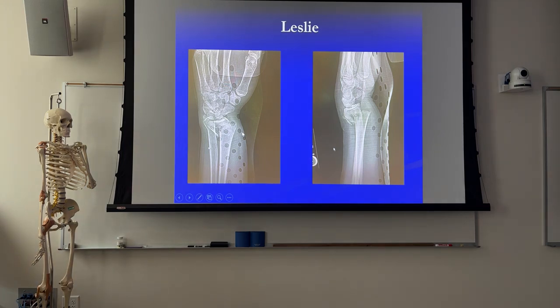That's my arm, actually! The reason the position is so good is because I wanted it to be good. I was in so much pain but I was like just get it done, so I ended up getting it pretty spot on. You did - there's the pisiform, there's the distal portion of the scaphoid, so it's almost a perfect lateral. Of the two, that's the more important one to see well-positioned. It's a little bit oblique - but if we had a scaphoid fracture, that little bit of oblique might have been beneficial.